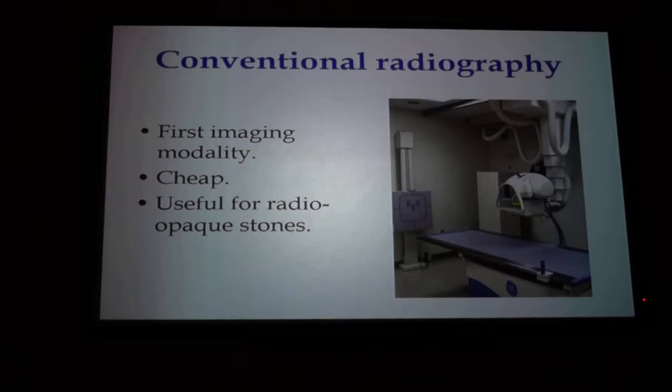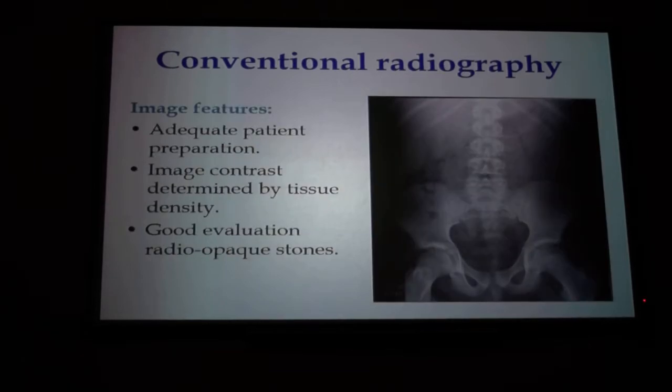Need the darkroom development that we had with the old film techniques. So it's quite an improvement. With X-rays, once you take an image, it appears immediately on your computer screen. This is what you get for an X-ray.